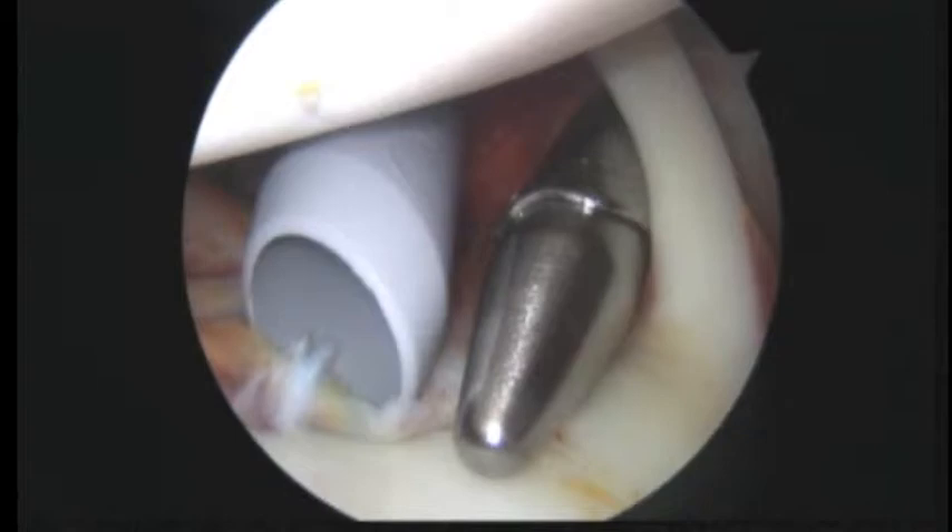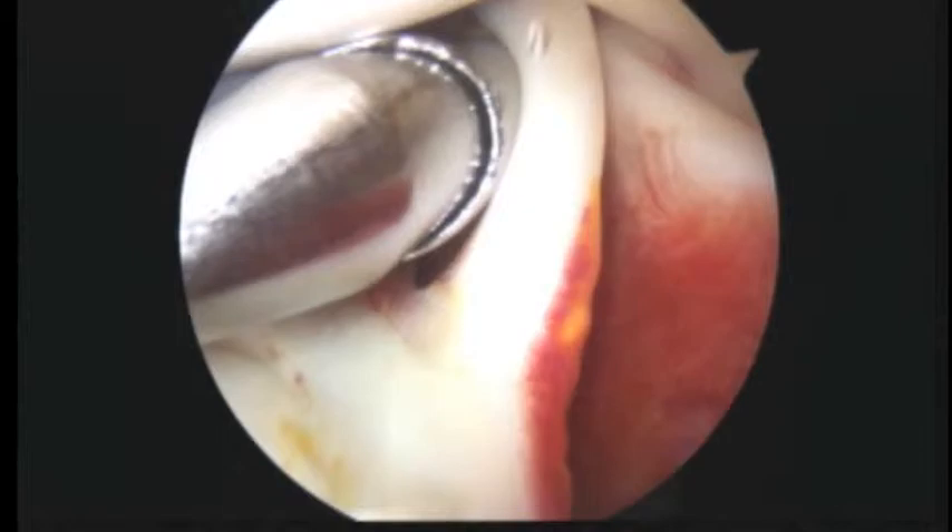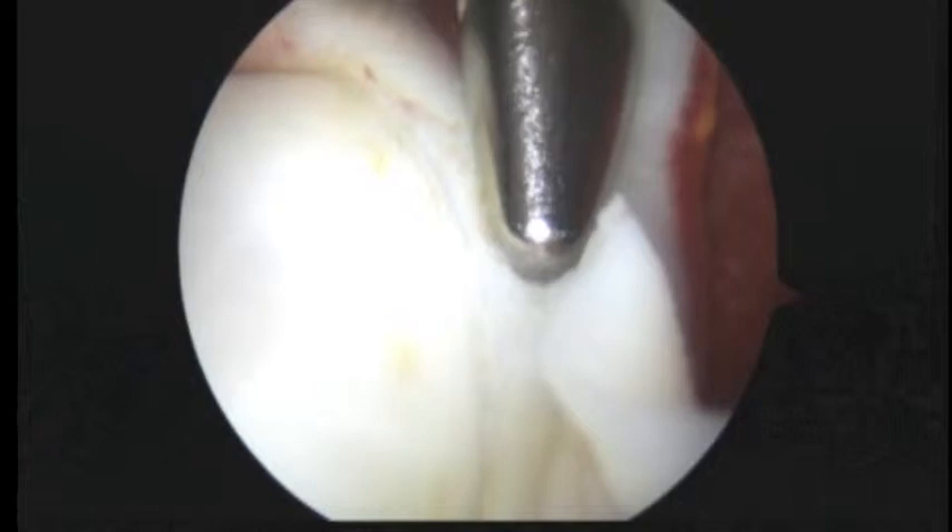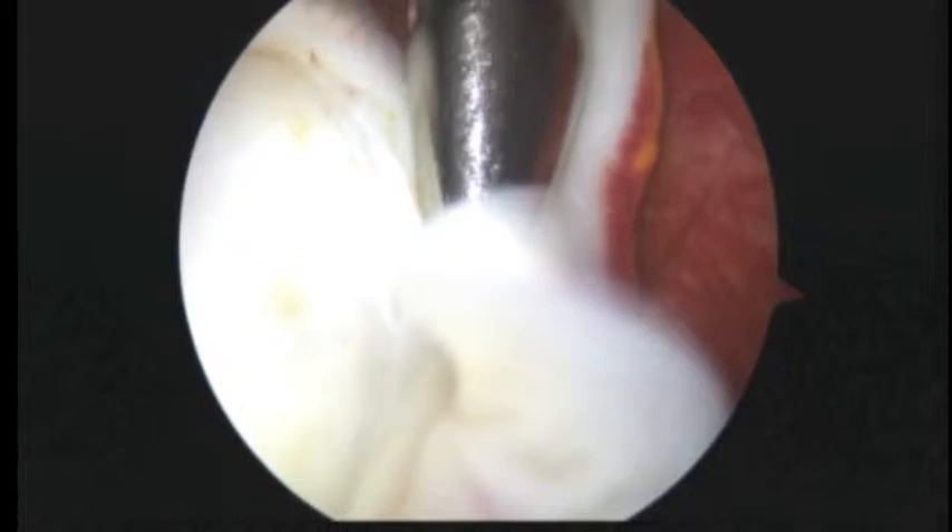There's a gray plastic one on the left — this is actually where we're going to be placing our camera in just a minute. To the right of that is your biceps tendon. As we look down here, we see a little bit of peel back, but really not too bad, so I don't think you technically have what we call a SLAP lesion, although it looks like it wanted to. That amount of injury is just a millimeter — that'll be okay.